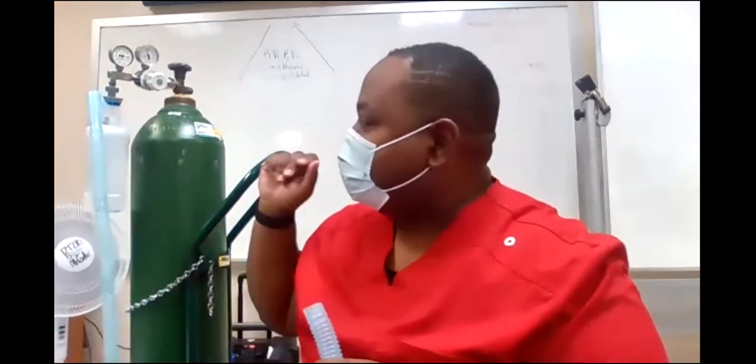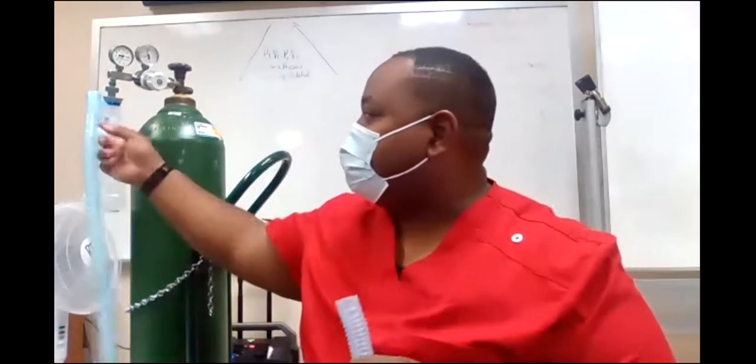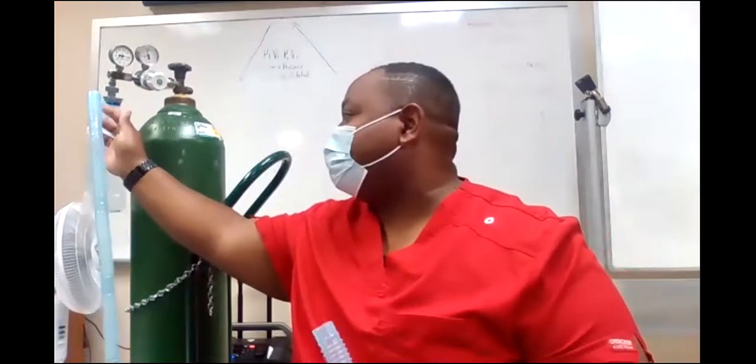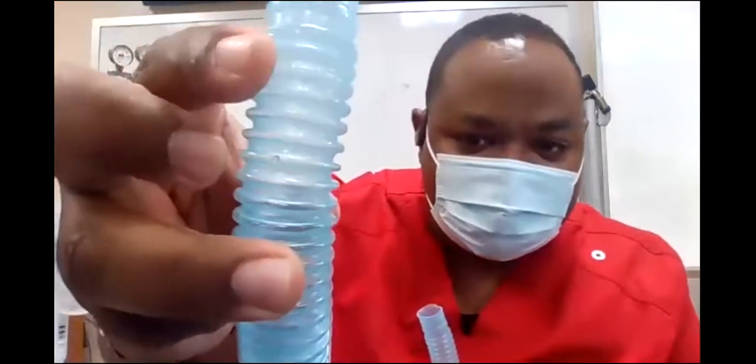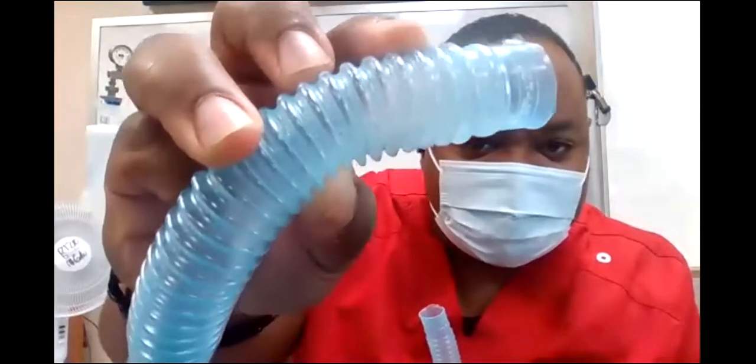So that's an aerosol T-piece. He's on 40% aerosol T-piece. Now you notice, if you can see, it's starting to bubble up right here, right? That mist is starting to collect. See that little mist in there, those water droplets? It's starting to collect. Over time, it's going to start coalescing. It's going to drop and turn into water. If I have my patient on a T-piece and I don't have a bag in the middle, that water goes right into his what? His lungs. So you've got to have that bag.